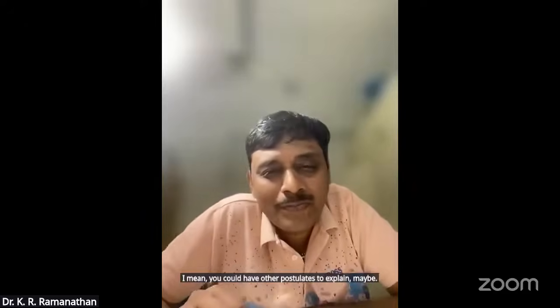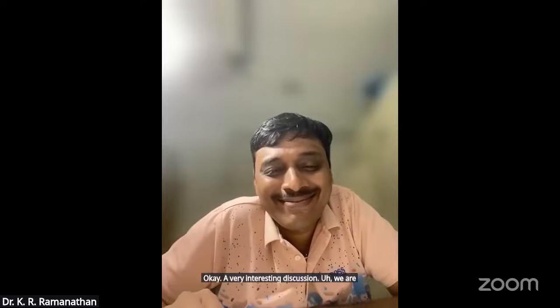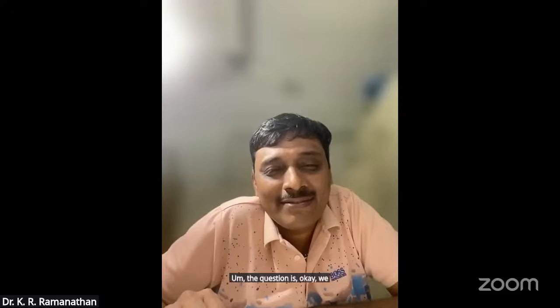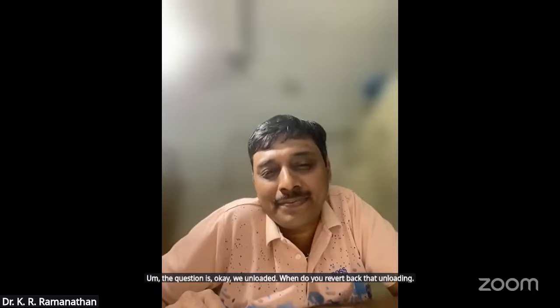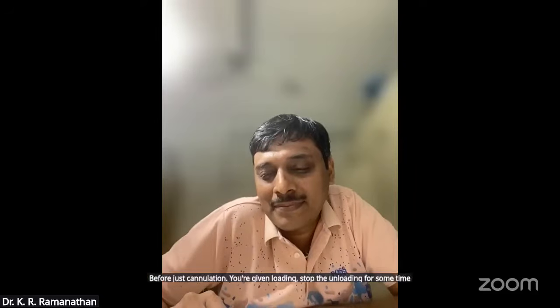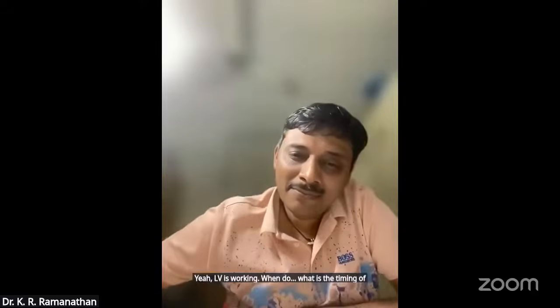Very interesting discussion. We are coming to the last part of it. The question is, okay, we unloaded. When do you revert that unloading? Before decannulation, you give an unloading, stop the unloading for some time and see how the LV is working. What is the timing of withdrawal of this unloading?